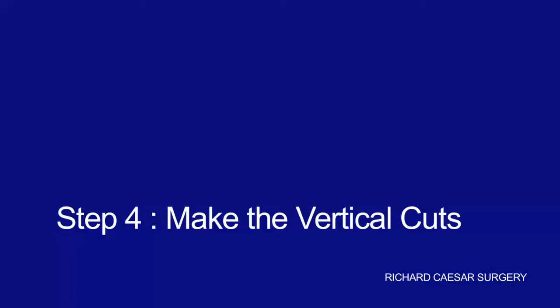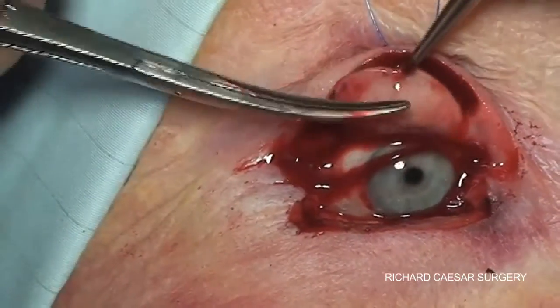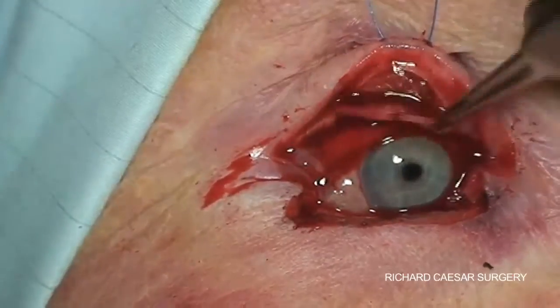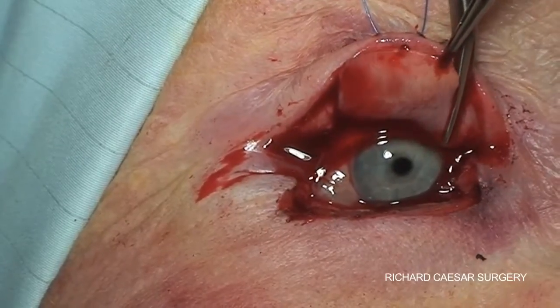The next step is to make two relieving cuts vertically into the superior fornix, cutting into the conjunctiva. These vertical cuts will allow the Hughes flap to pull downwards without causing eventual retraction of the upper lid when the Hughes flap is released.